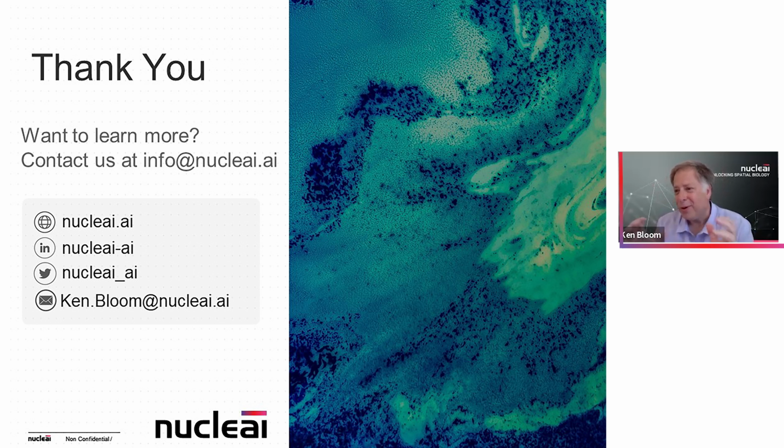Famous studies with him where if we sent off all of our things, we went back, and once we got immunohistochemistry, just basic immunohistochemistry, cytokeratin, vimentin, LCA, S100, are you melanoma, lymphoma, sarcoma, carcinoma? What we found was that 50% of what the expert had classified by H&E was wrong. Now, that didn't mean it couldn't be classified by H&E. Once we got the immunostains and understood how to classify, then we adjusted criteria. And within 5 years, the H&E was back up to over 90%, because we now knew what to look for.